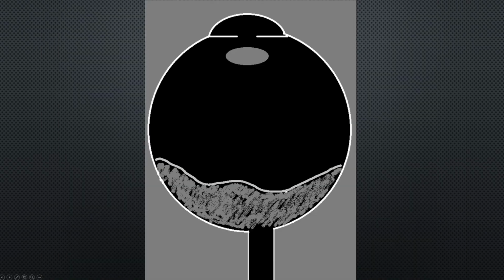So here is a drawing of a posterior vitreal detachment where you have not the retina, but the vitreous detaching from the posterior wall of the eye. Usually people are coming in with floaters, flashing lights. If this happens, less vision loss.